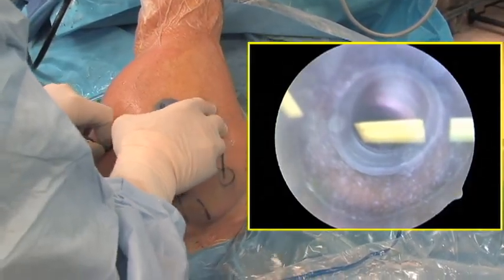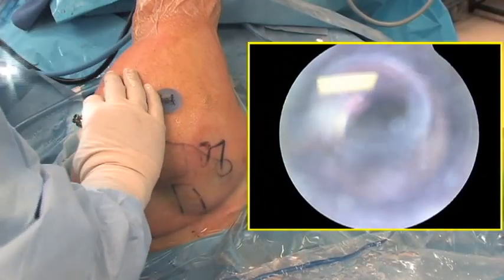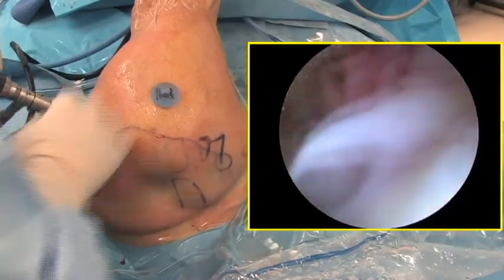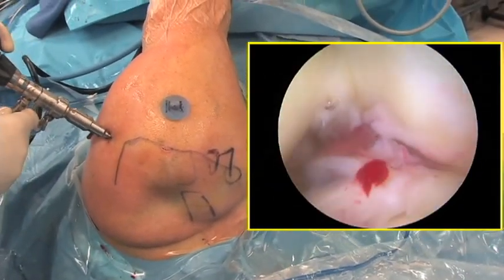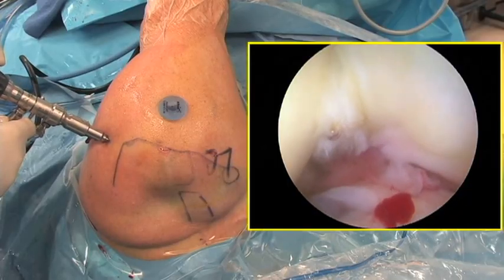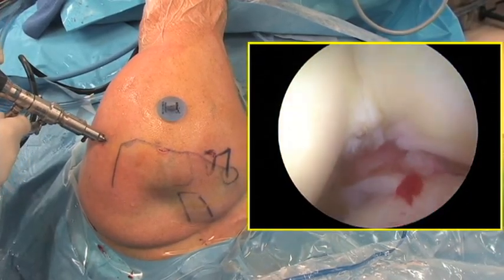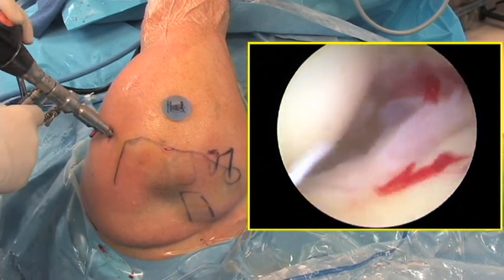If desired, the repair can be inspected from back inside the glenohumeral joint. Note that the rotator cuff has been reduced nicely to the articular margin. The rotator cuff repair is now complete.